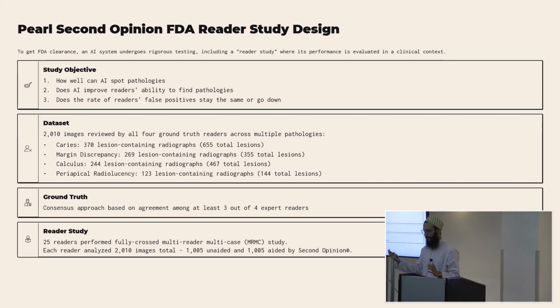For day-to-day activity, the purpose of that was to just get rid of the completely nonsensical stuff. And so when I built it at least, it was before we had that tooth parts thing, that was before all that. So then you did have random stuff in a cone cut, right? And you had all this weird stuff. So we were just like, what's the fastest way that we can make it so this isn't just bad?